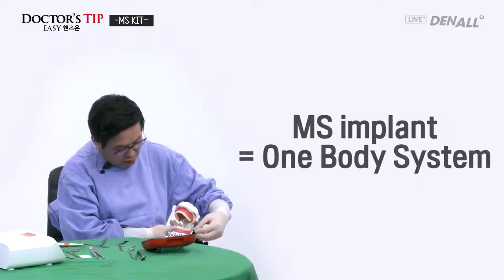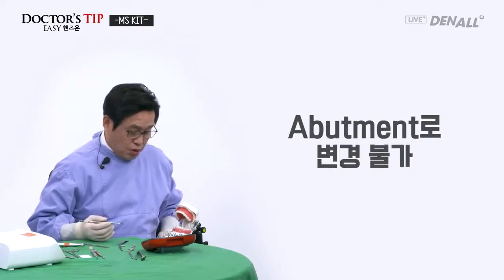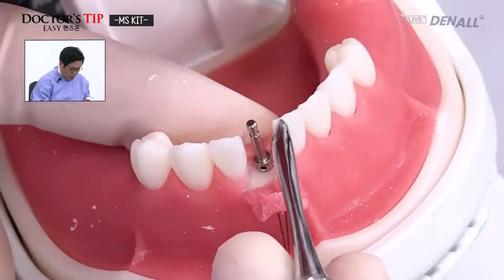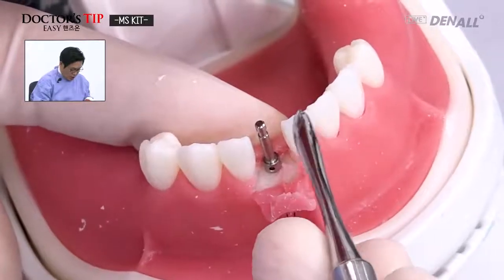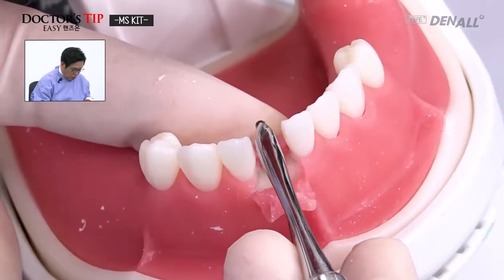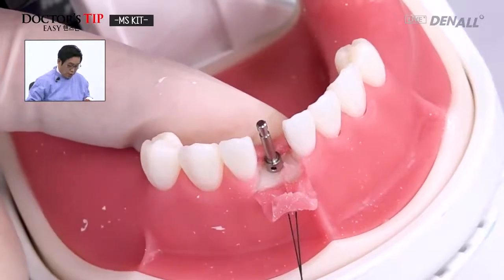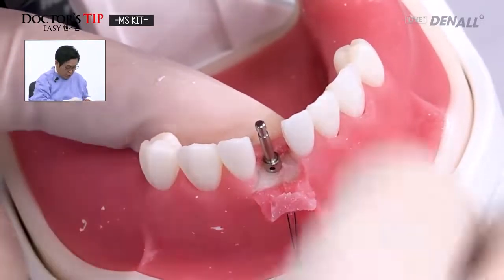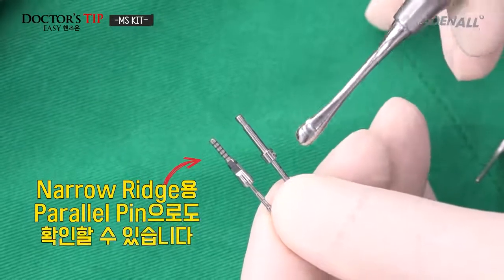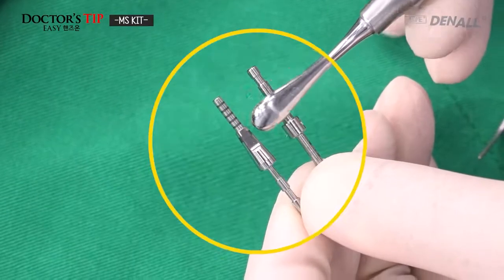And again, this is a one body implant, so the path is important because you cannot change it with an abutment. And like this, in the adjacent teeth, the incisal edge line, you check against that. So it's tilted about 0.5 to 1 millimeter toward the lingual, and on the longitudinal axis, the path is like this, and this is the guide pin.